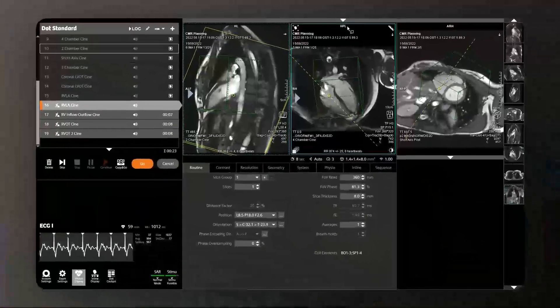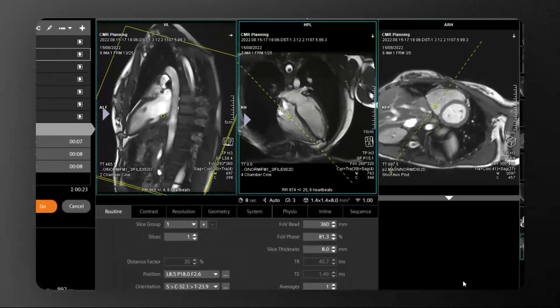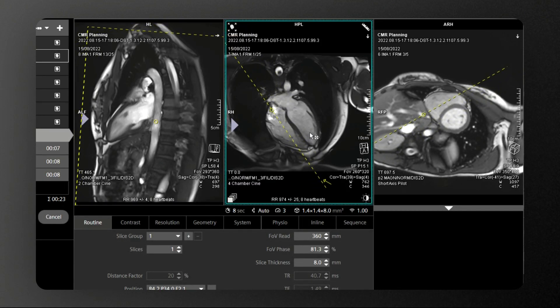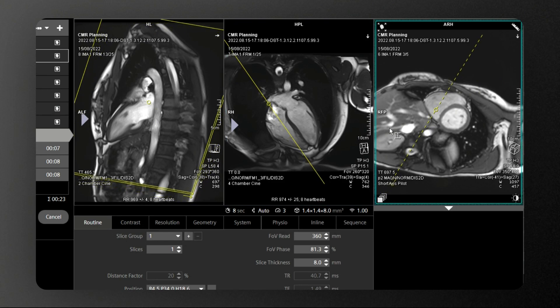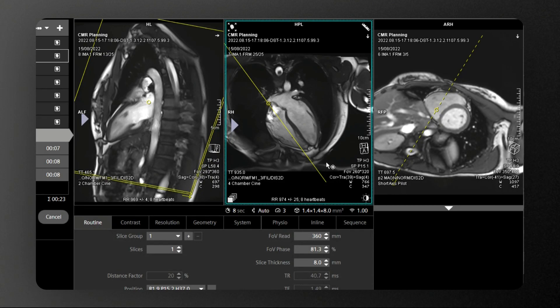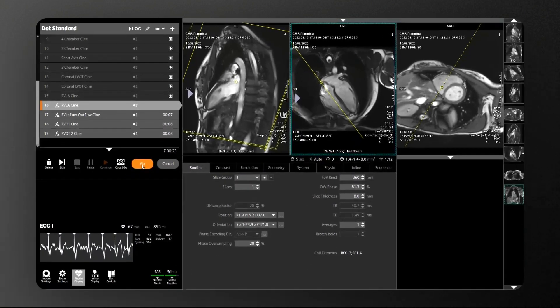The first specific view of the right side of the heart we'll study is the Right Ventricular Long Axis, or RVLA view. The RVLA is essentially a two-chamber view of the right side of the heart. It can be planned by copying the image position on the two-chamber of the left ventricle, then shifting the slice into the right ventricle. Click perpendicular on the four-chamber cine to align the slice perpendicular to the reference plane, then prescribe the slice through the right ventricle and tricuspid valve into the right atrium, almost parallel to the septum. Using a systolic frame for planning is recommended due to septal motion during the cardiac cycle.